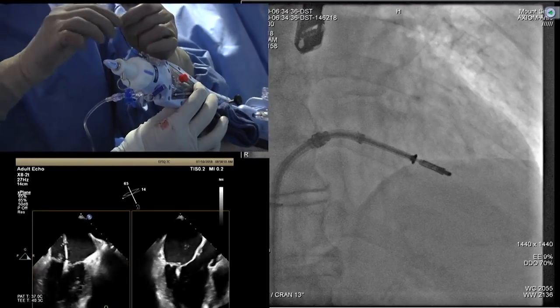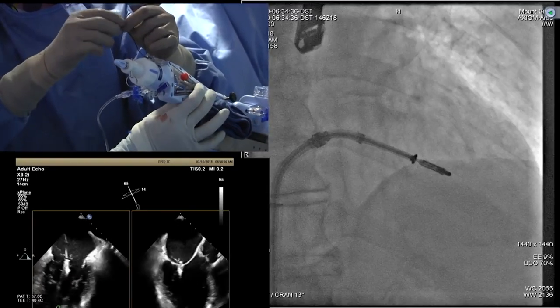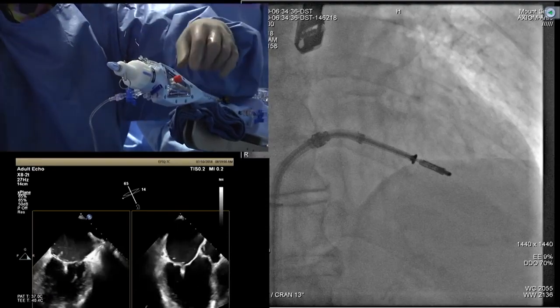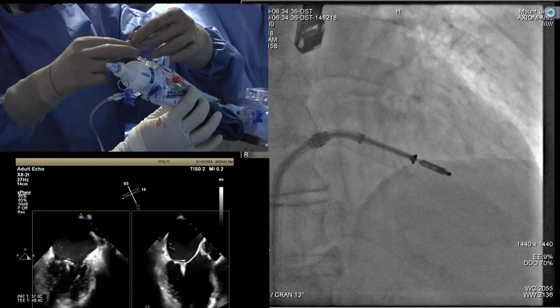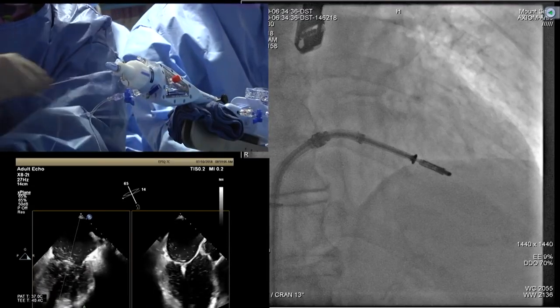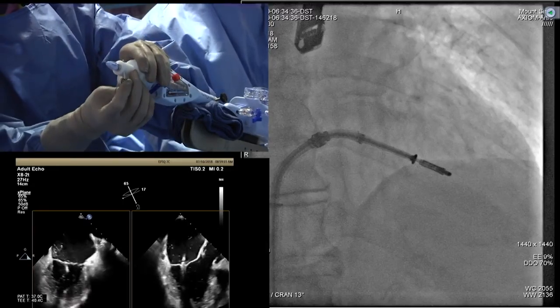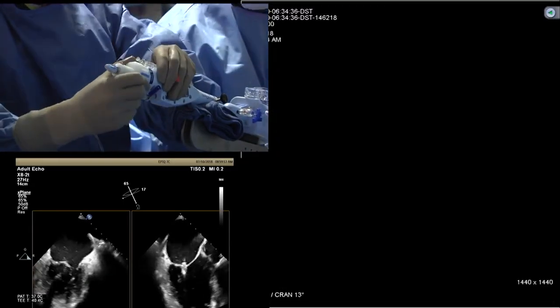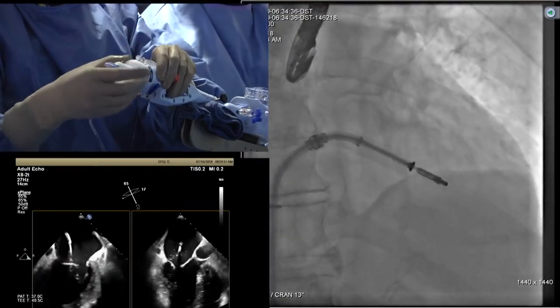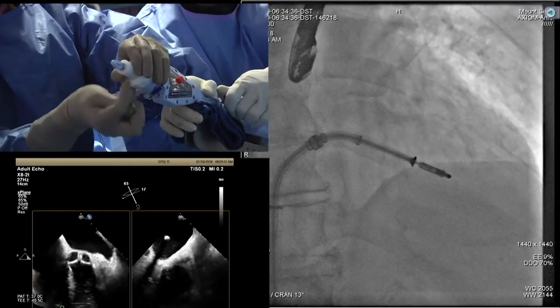How did this come out like that? Yeah, we'll cut it. This is a bad knot. So just take it out. Okay, release, unrelease, right? Neutral, right? Then leave it neutral. Yeah. Good.